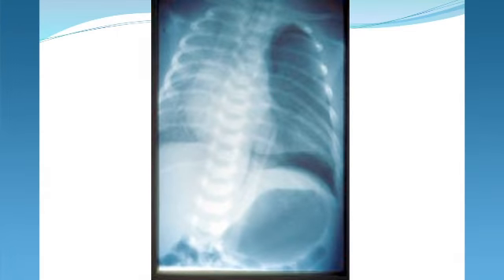And this is a preemie who's got a fairly normal right lung, but has a pneumothorax on the left. Again, you don't need real high mean airway pressures to keep that right lung open, and you can avoid further air leak by using pressures that are a little bit lower.